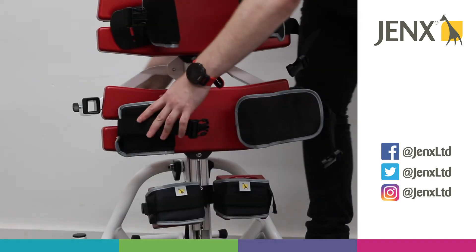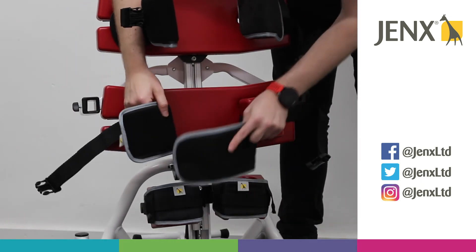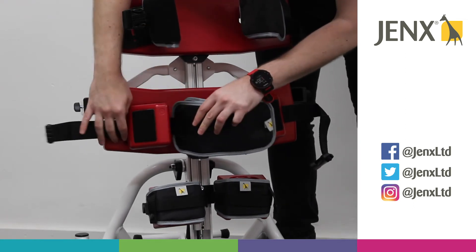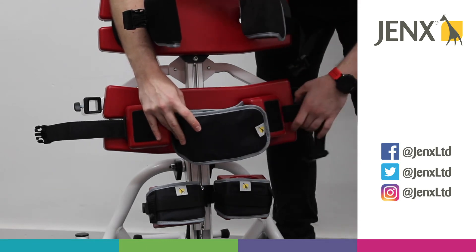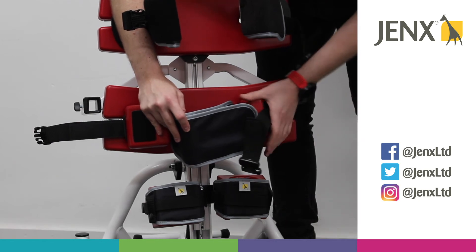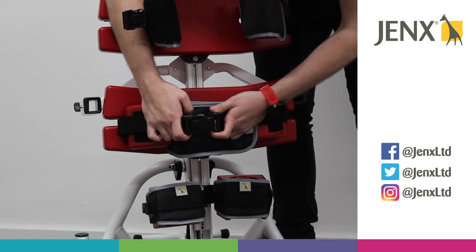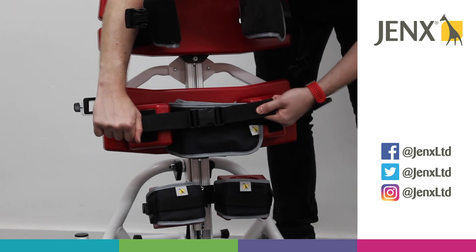As you can see, we've got a velcro strap for the hips and this wants to be going over the pelvis, slipping into place. Now if you have got any rotation that you'd like to correct, by pulling either side of the strap, that will adjust any rotation that you need to correct. We can then clip the safety strip in place and then tighten.